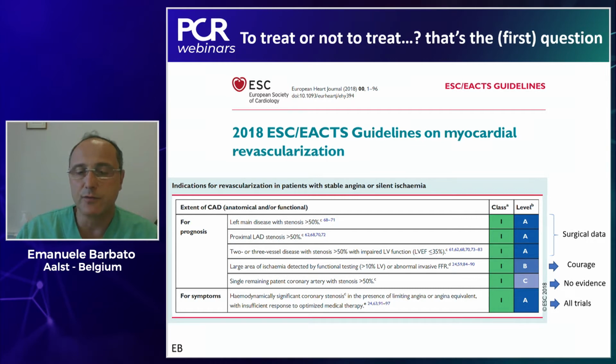For symptoms, for sure, we know that this patient is symptomatic, has typical stress angina. And what we also don't know, and this will be again a question to the colleagues from Verona, is whether this patient did an attempt with a maximization of the medical therapy before considering coronary angiograms. But, you know, these are all ex post reasoning, useful to fire up the discussion.